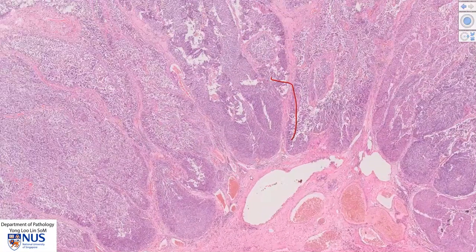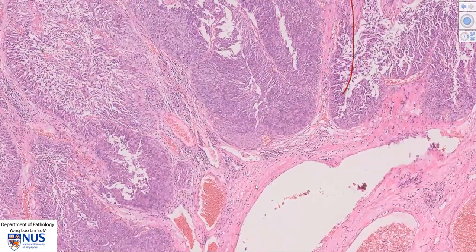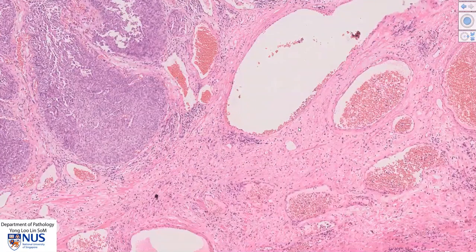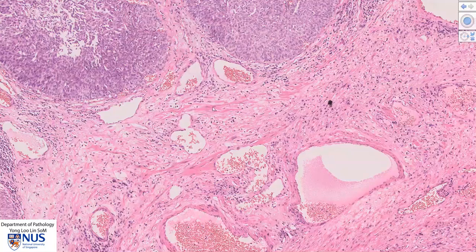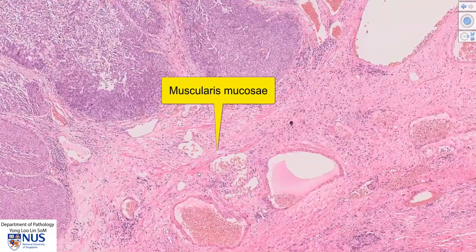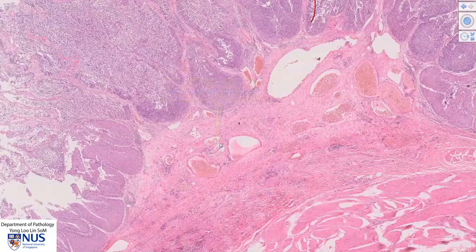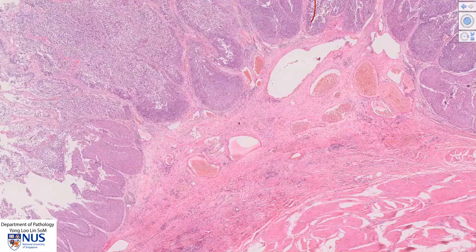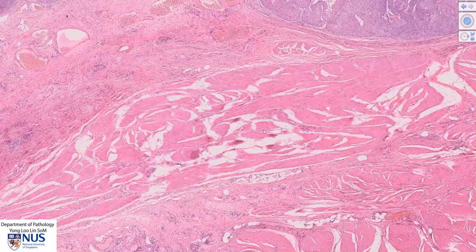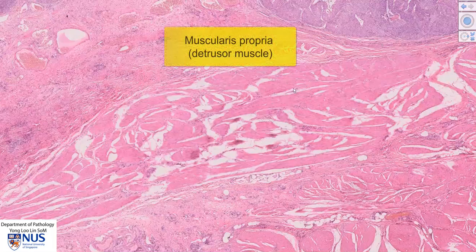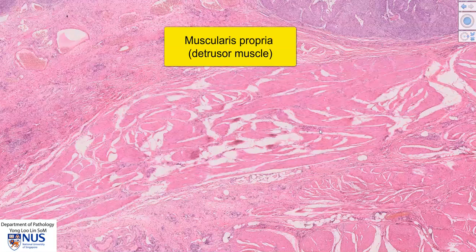Just beneath the urothelium we have the lamina propria, and we can see some blood vessels here. We also see some very delicate, thin bundles of smooth muscle. This is not the muscularis propria, but rather this is the muscularis mucosae. It is still part of the lamina propria of the bladder wall, unlike these very thick pink muscle bundles, which is the detrusor muscle or the muscularis propria.